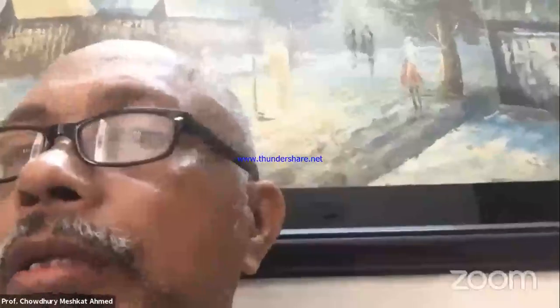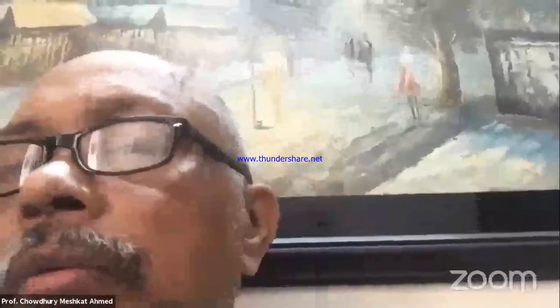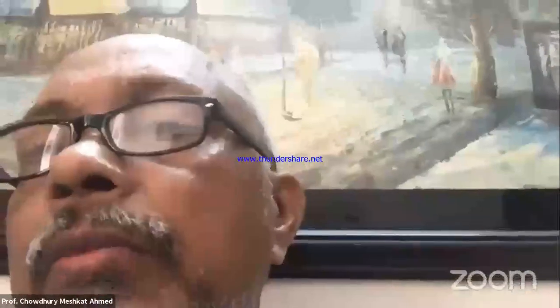Yes, there are differences in defining mild, moderate, and severe. I personally use 40 to 50 as mild, 30 to 40 as moderate, and anything below 30 as severe. Some people put the demarcation between mild and moderate at 45% ejection fraction.